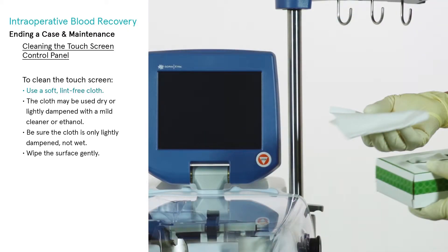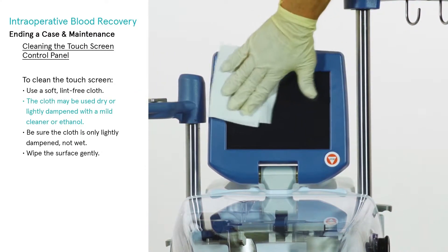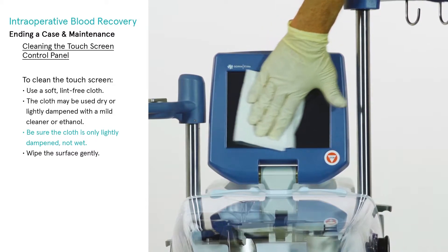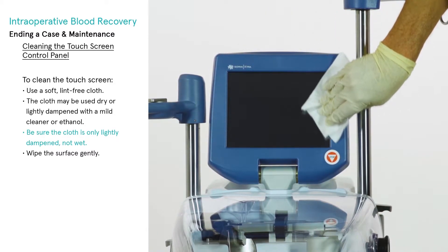Cleaning the touch screen control panel: to clean the touch screen, use a soft lint-free cloth. The cloth may be used dry or lightly dampened with a mild cleaner or ethanol. Be sure the cloth is only lightly dampened, not wet. The cleaner must be neutral in pH — neither acidic nor alkaline.